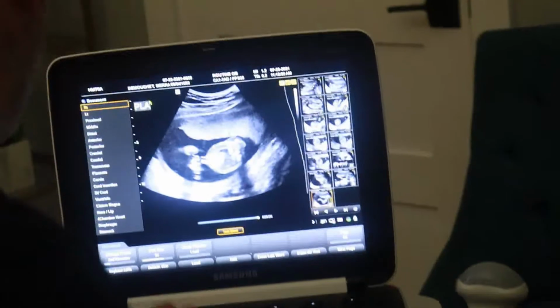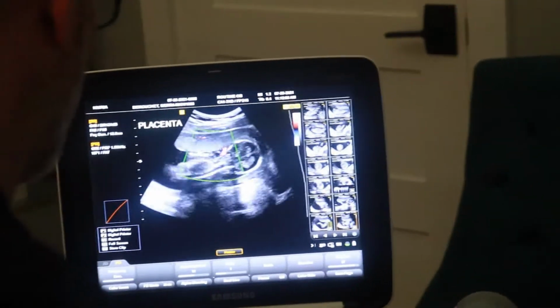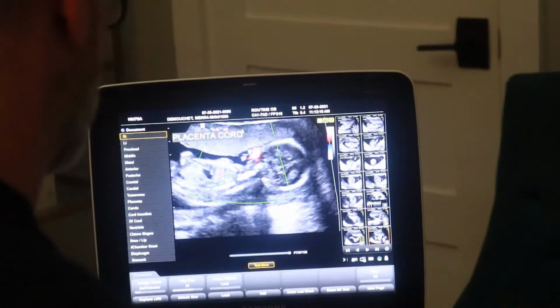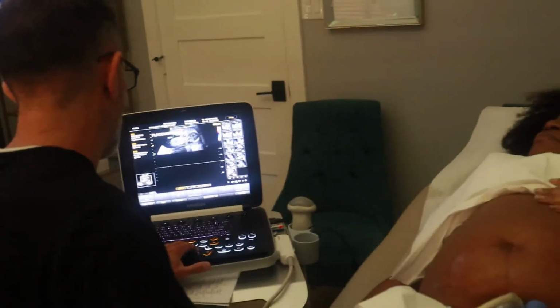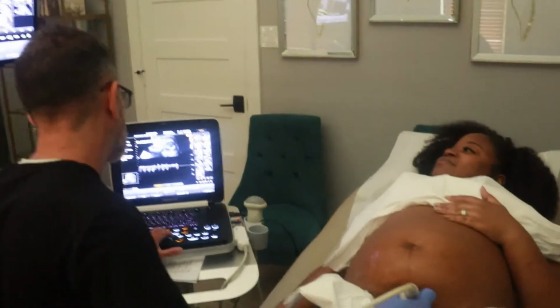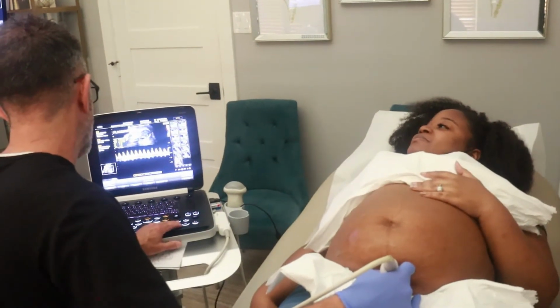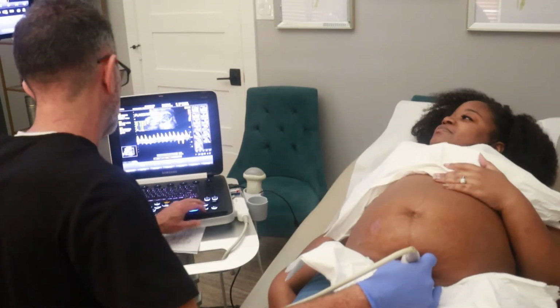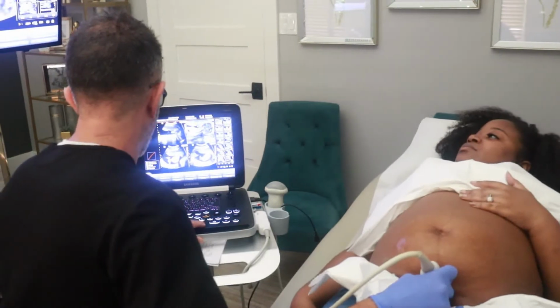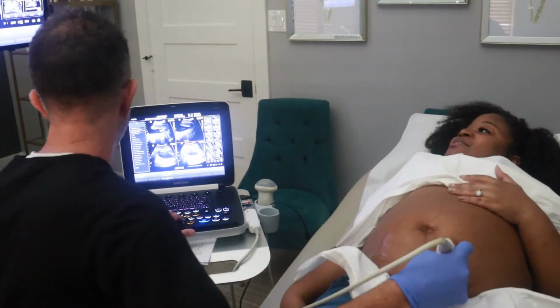Alright, like I said, placenta anterior. It's on the front side of the uterus. I'm getting butterflies over here, y'all. It's coming. Hang on, I'll give you a fair warning. We're about to look at the blood flow in the umbilical cord. Take a little flow measurement in that cord. And it'll show that you've got a normal amount of amniotic fluid, which is all the dark around the baby. Good job, babe. Good job producing all that fluid.